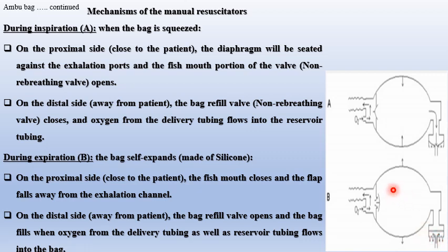At the same time, on the distal side, away from the patient, the other non-rebreathing valve, which is the bag refill valve, opens, and the bag fills when the oxygen from the delivery tubing as well as the reservoir tubing flows into the bag.